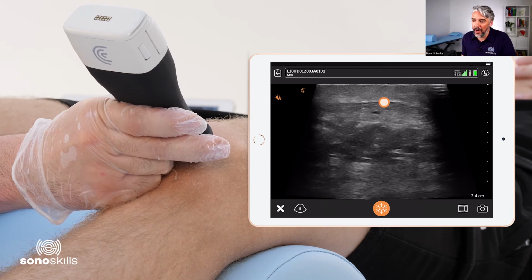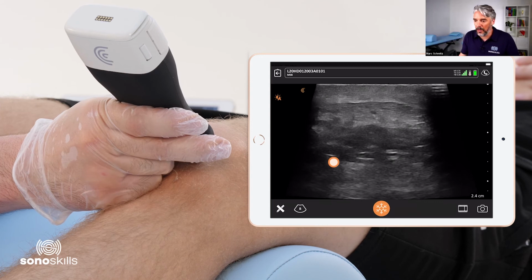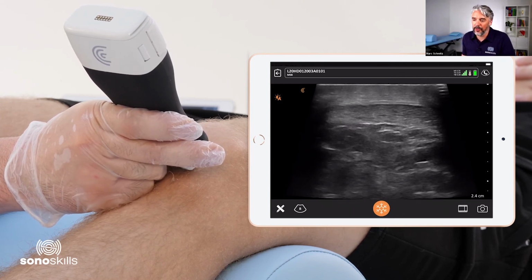And we can see a nice boundary of the tendon, and in the depth, indeed, Hoffa's fat pad. Okay, so let's follow it down to distal.